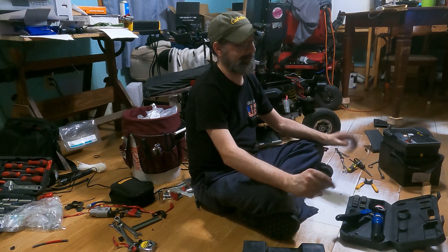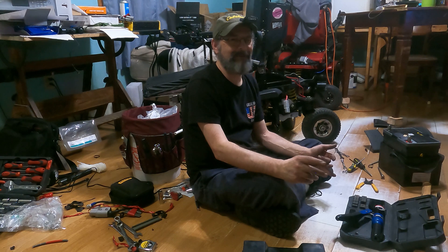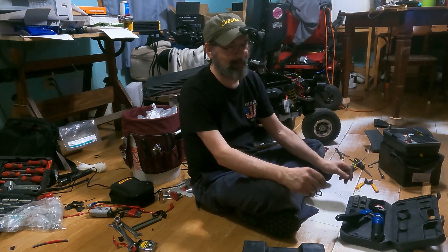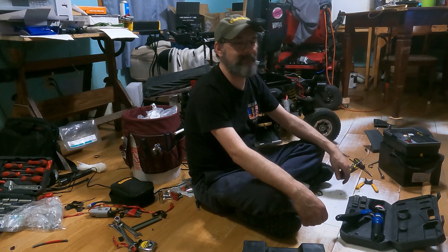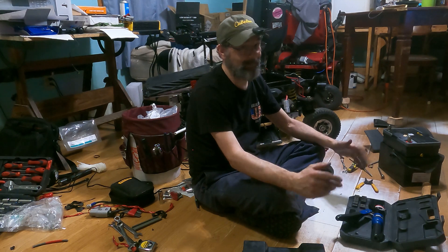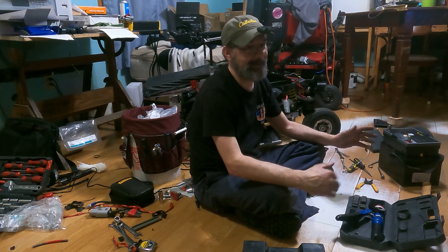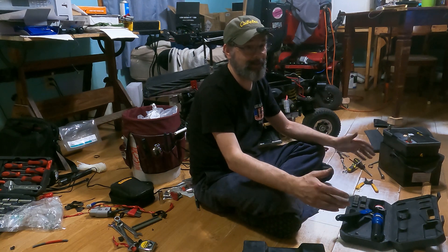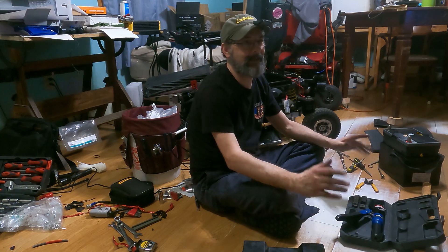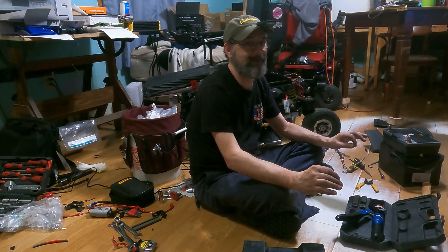Just a reminder — because this has been a full day of modifying an existing chair, adding some things and taking others away — pay very close attention to your wires and always double-check yourself as you go through things. I thought I had the right connections, then traced back and realized I didn't. Always retrace your steps before you ever put power to anything. Never assume you're right, especially when working on a chair that already has so much existing wiring.